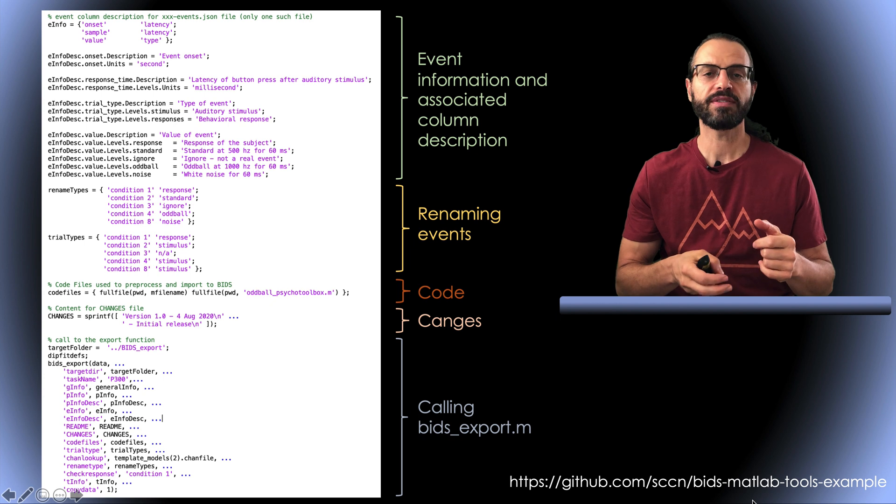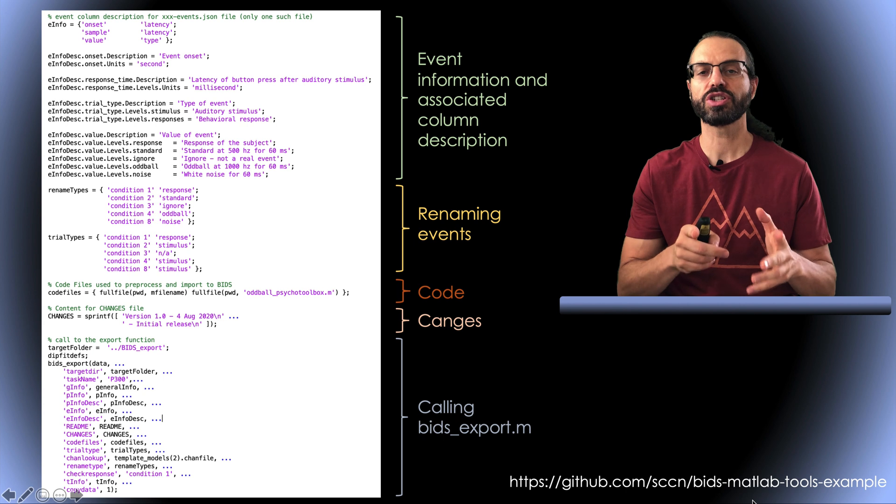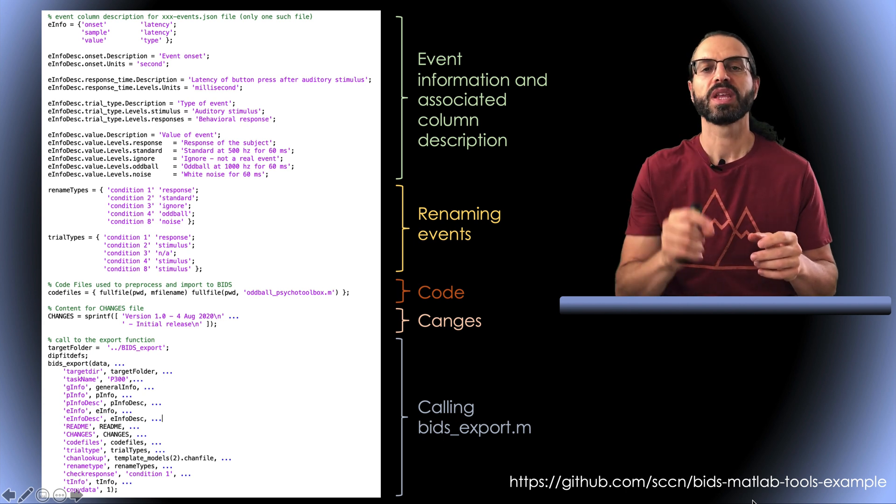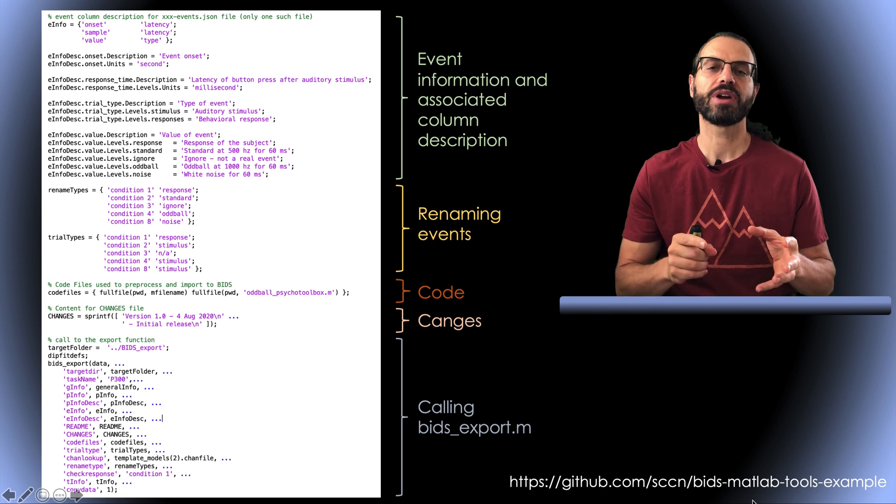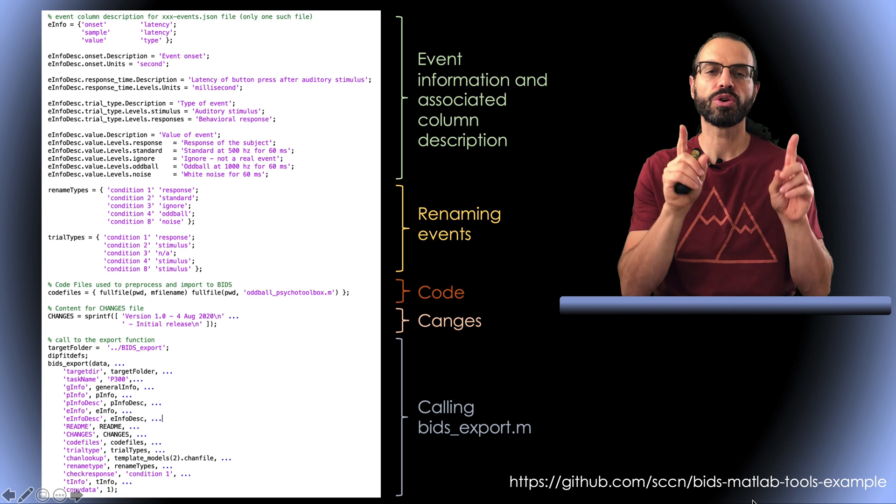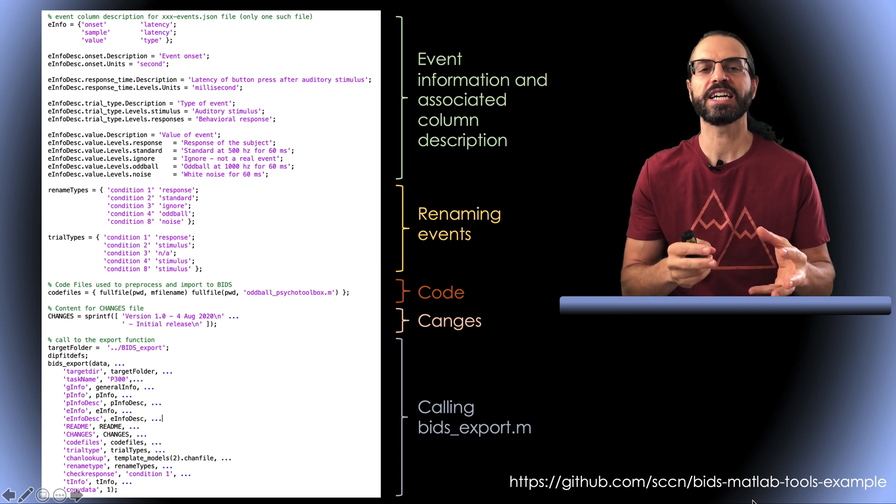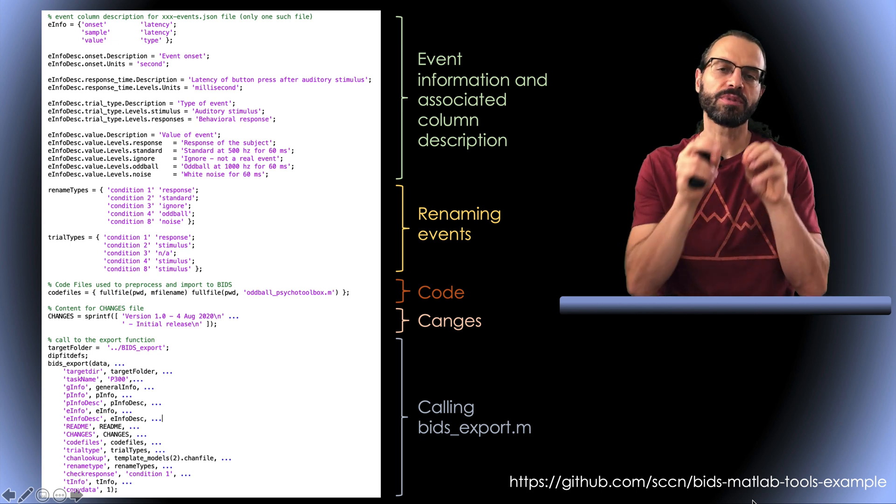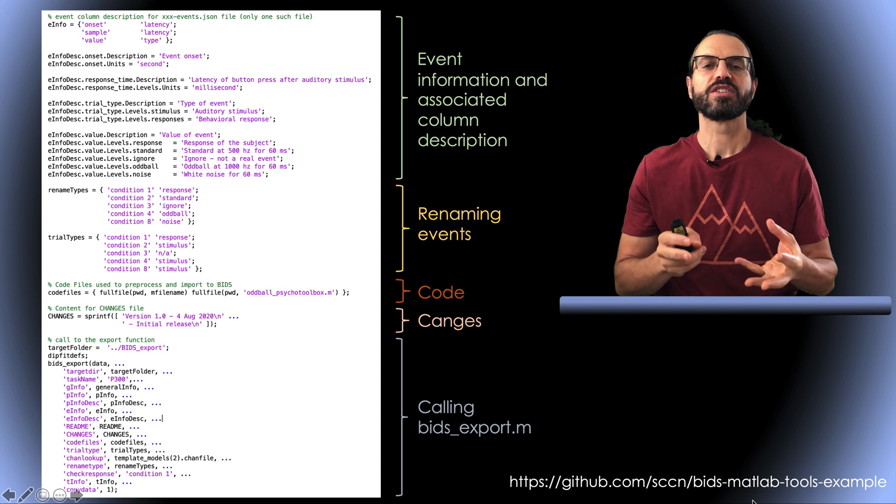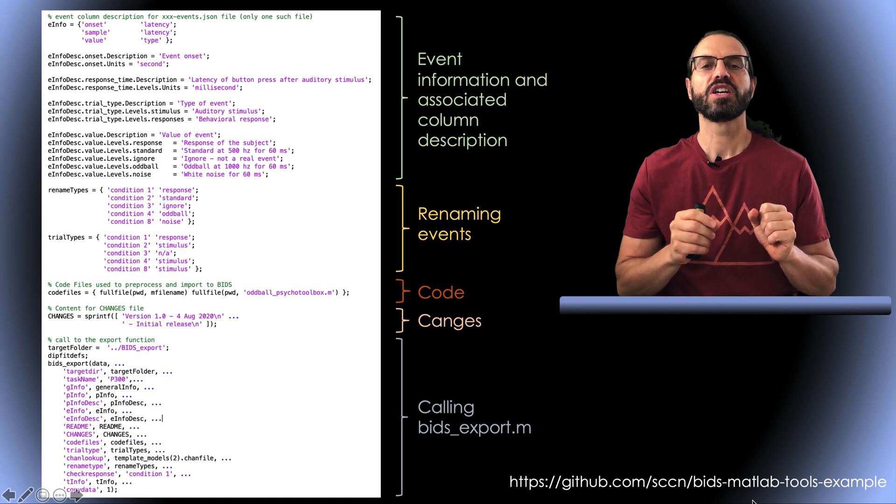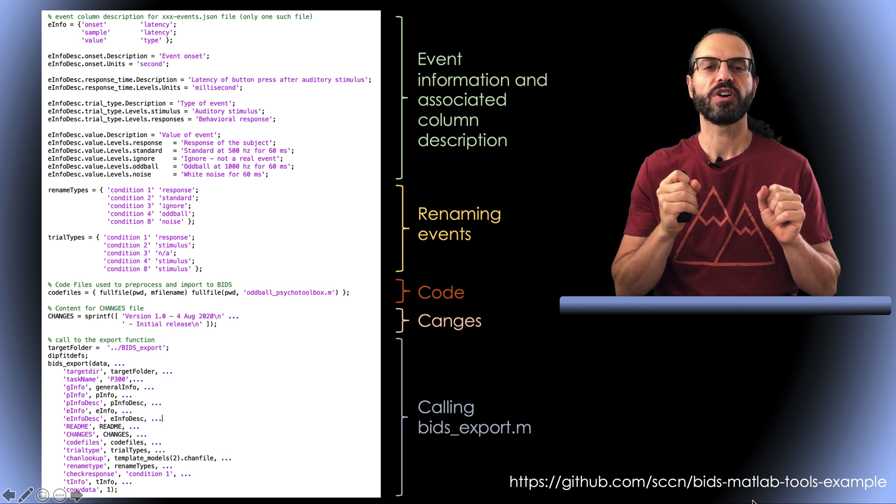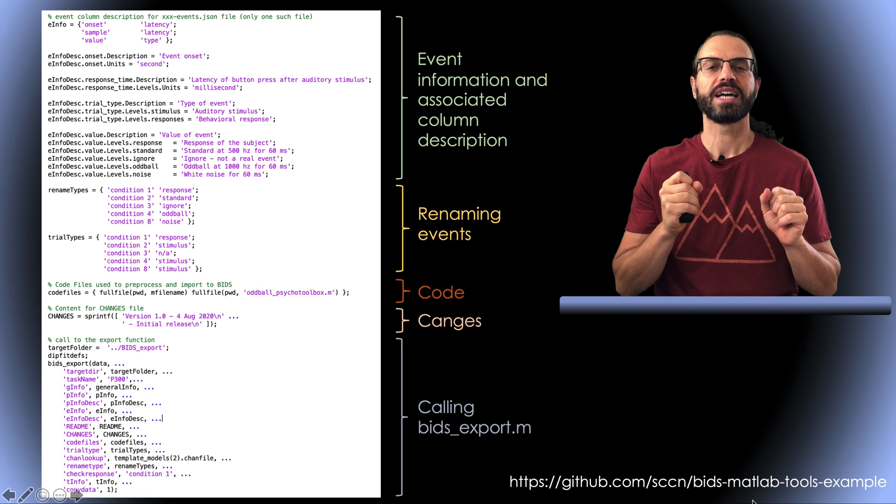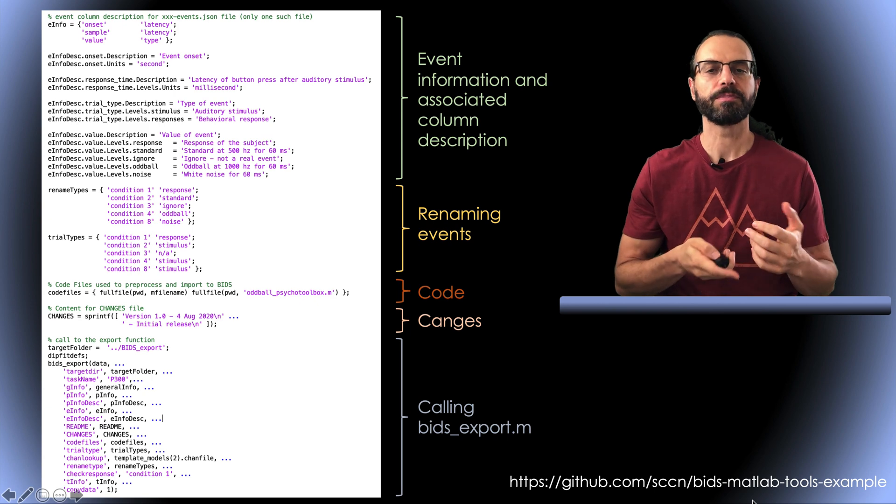Then we have event descriptions as well as event column file descriptions. These are special options to rename EEGLAB event types and define new trial types based on EEGLAB event types. These options are not available on the graphic interface. Then we have a section of the code to include. In this case, we're including the function used to present stimuli as well as the current script. Note that exporting the code is not available from the graphic interface because you can simply copy these files to the code folder of the BIDS exported archive. This is the same. If you have stimuli, you can create a stimuli folder and copy your stimuli into it. Most of this script is about building a parameter list for the export function. So here at the bottom, we have the export function. So download this script and the associated data, run it, then modify it to prepare your own data.